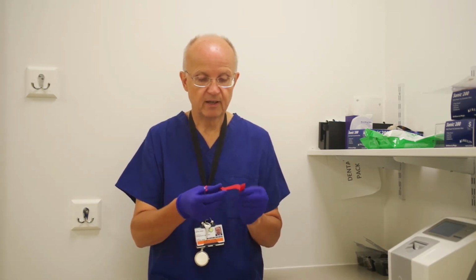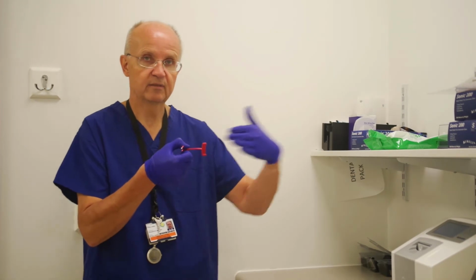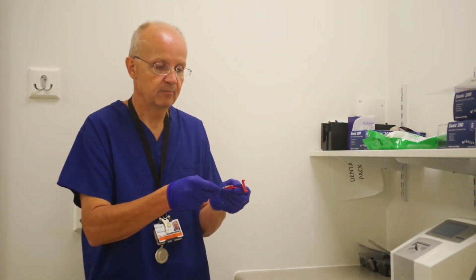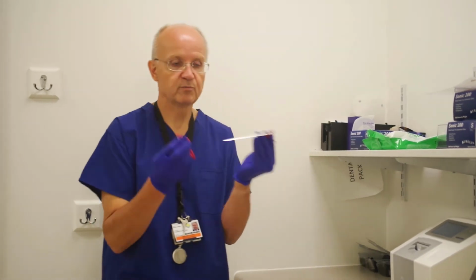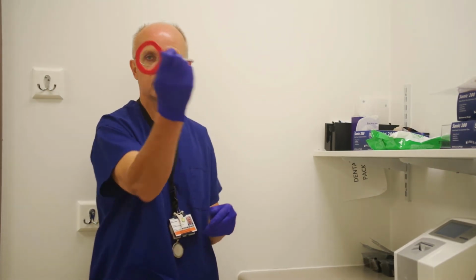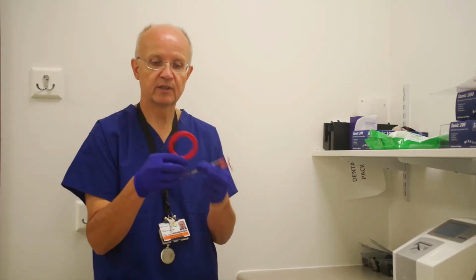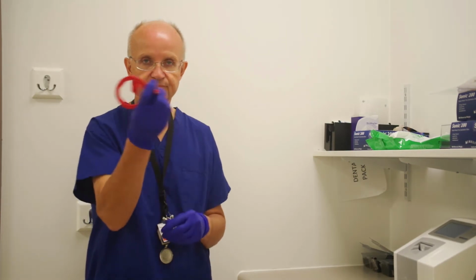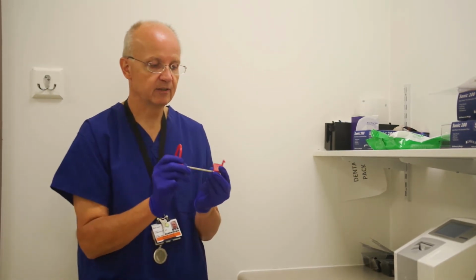So we simply hold the holder like this, looking at it with the film facing away from us. We take the guide and place it in that way, so it's come towards us. And once more, we put the ring on there so that we can see straight through the middle. Again, this ring is exactly like the blue one. The bar comes out from the bottom there, so there's only one way to put it on. Okay, so that is how we set up an adult bite wing.